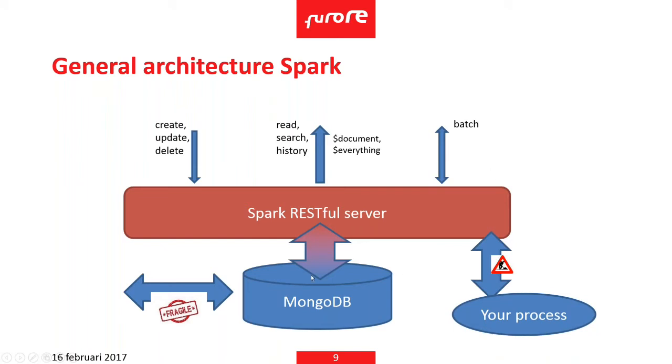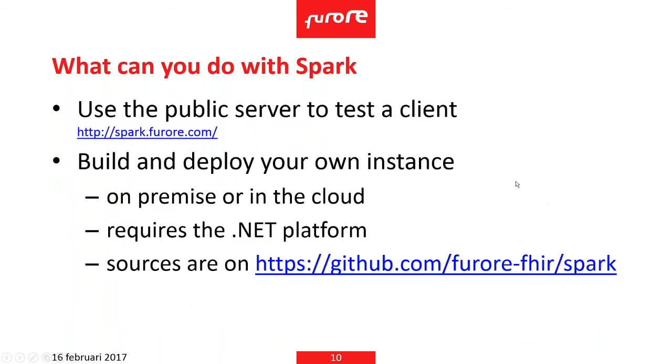If you want not just a database as a backend, but for example, your own process, because some resources, let's say if you want image resources to come from a PAC server for something very strange, you could plug it in at the backend, but it's not very easy to do. That being said, it has been done. I know of at least one organization that has replaced the MongoDB with several of their own web services, and they host the data from there. So it can be done. It's just that it's not that easy.